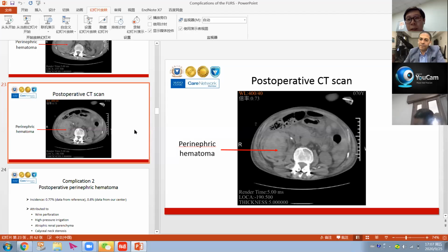I think, and we have met this situation. But it has the other risk factor that usually the perinephric hematoma makes a tamponade and can help to stop the source of the bleeding. So we have to make some balance and evaluate case by case. If I can keep it without interruption, or if there is a high risk of perinephric infection, I can put a small drain. So there is no fixed rule. It can be evaluated case by case. Any further questions, my dears?